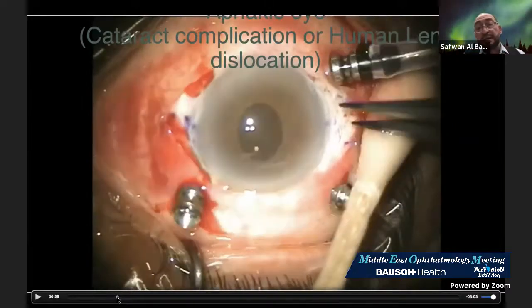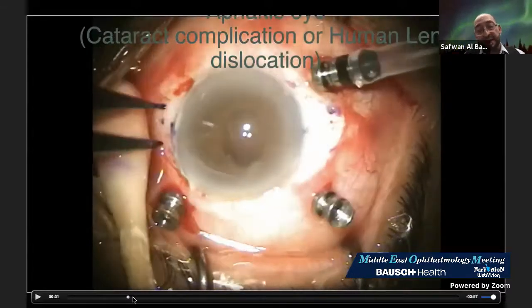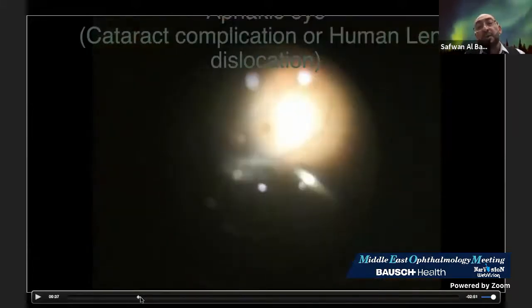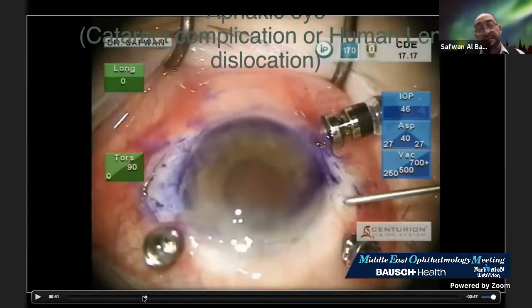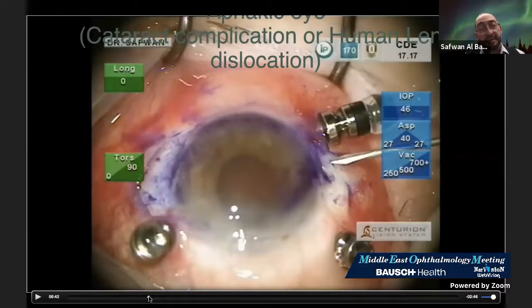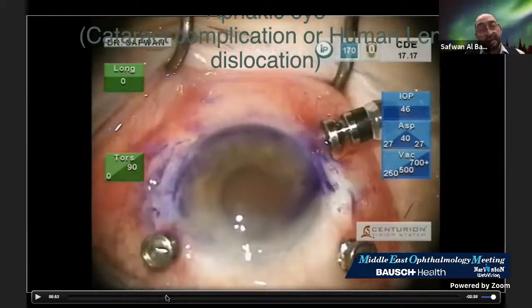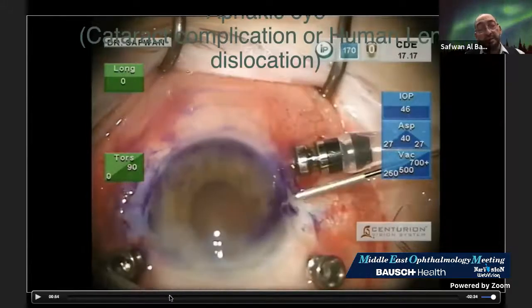So here, when I had prepared everything, I went to finish my work inside the eye, where I removed all the lens material and returned back. Now, in this step, I will go with the MVR and open the sclerotomy site here. I make sure that I'm in, tip in, and then I will test my gauge 23 forceps.